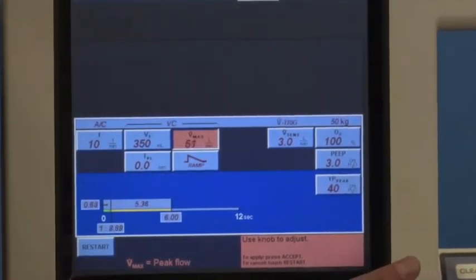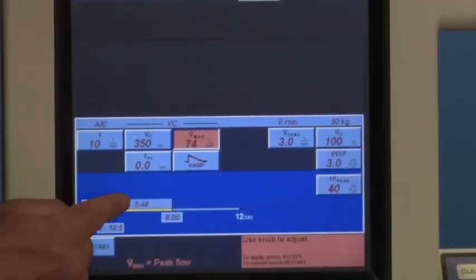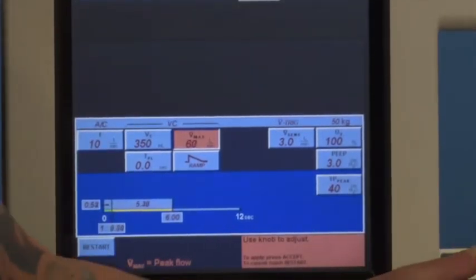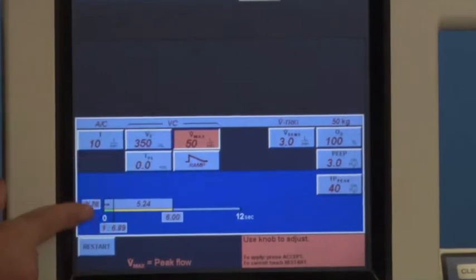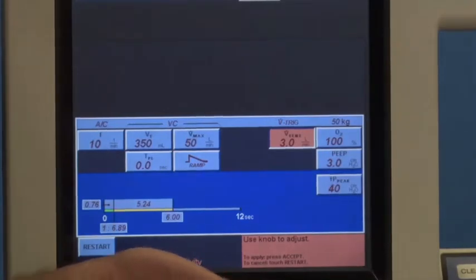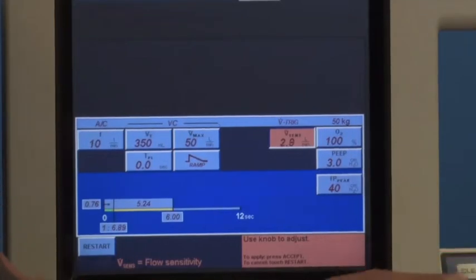And you can see that an increased flow rate impacts inspiratory time and expiratory time and the IE ratio. So you have a very easy visual to help you pick and choose an appropriate flow rate, either based on patient need or something about inspiratory time, IE ratio related. Again, there's flow trigger. The machine defaults to 3 liters per minute for an adult. If for any reason your patient is struggling to trigger, then you might lower that a little bit.